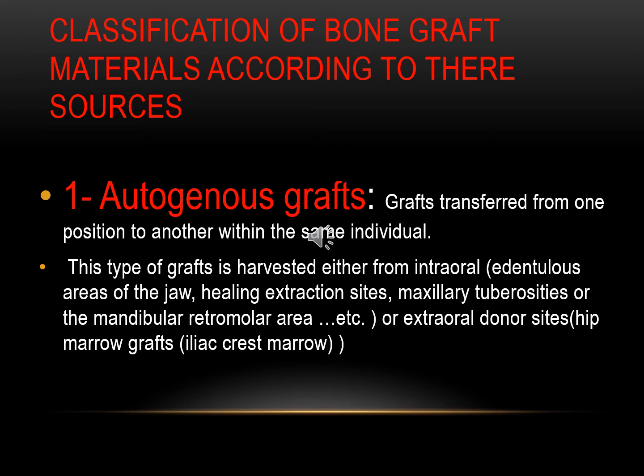The most important extraoral donor sites are the hip marrow graft and the iliac crest marrow. For the intraoral donor sites, we will talk about them in the next slides.